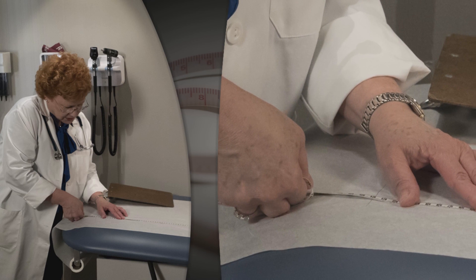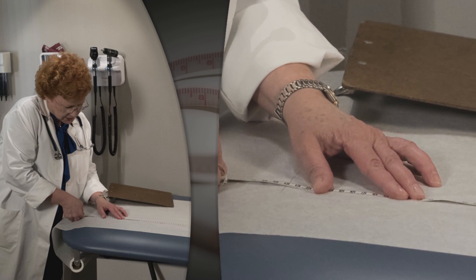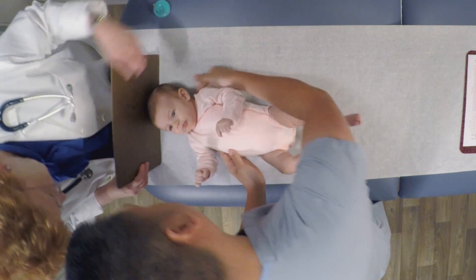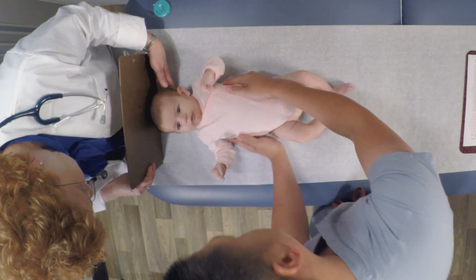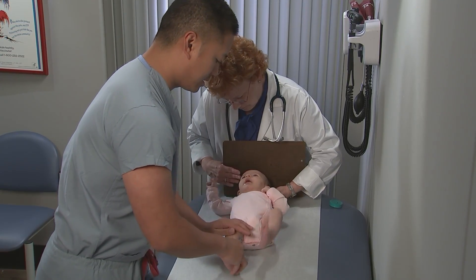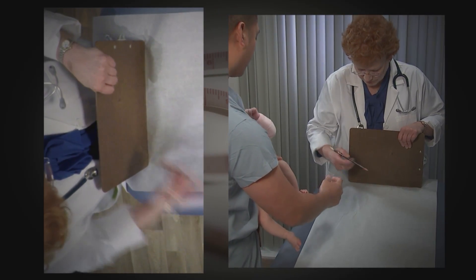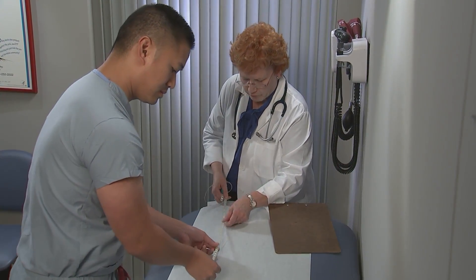If an infantometer is not available, a non-stretchable measuring tape can be used. Positioning the infant's head against a wall or other vertical flat surface is the best way to mark the head position. The infant's legs are then extended as before. The heel position is marked and the distance from the wall to the infant's heel is measured with a tape.